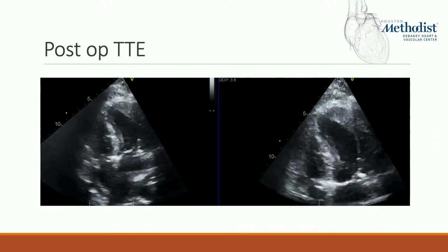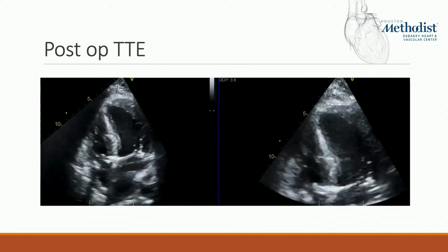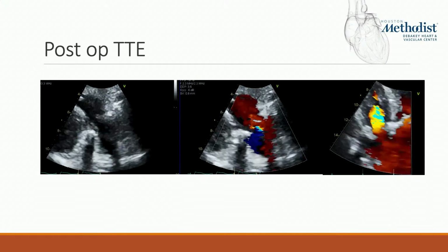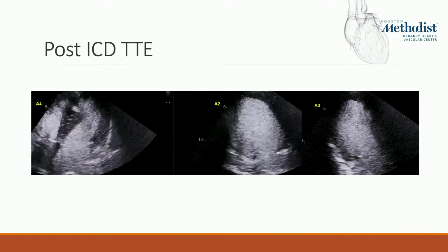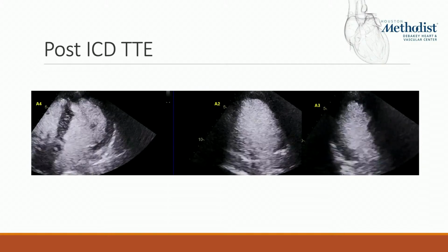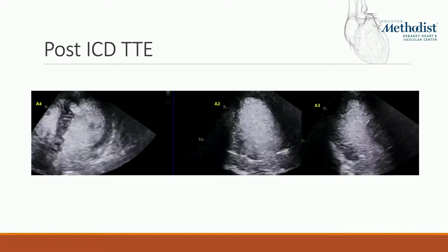After the tricuspid valve replacement, this is the follow-up echocardiogram post-CABG, which showed normal biventricular function with little evidence of tricuspid regurgitation and a well-functioning prosthetic valve. As I stated, her course was complicated by graft occlusion and VF arrest. So this is the follow-up echo with a severe LV dysfunction and ICD implantation.